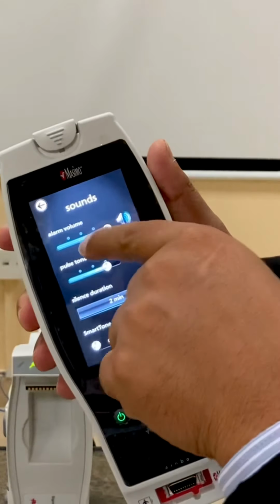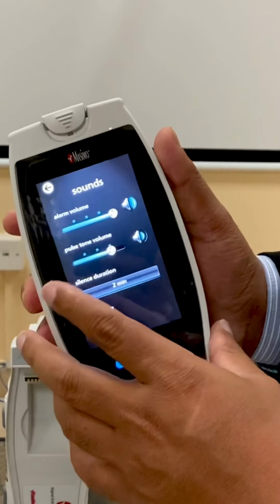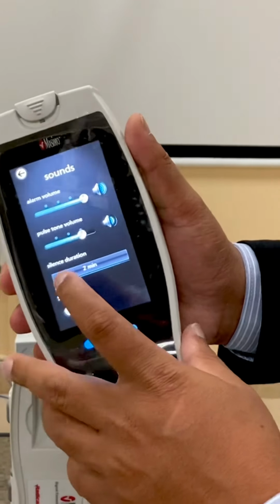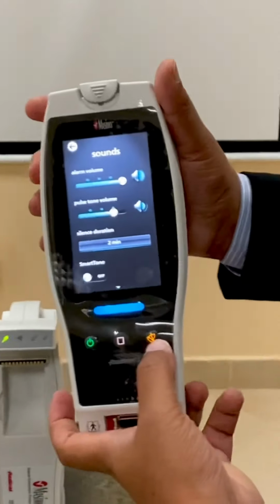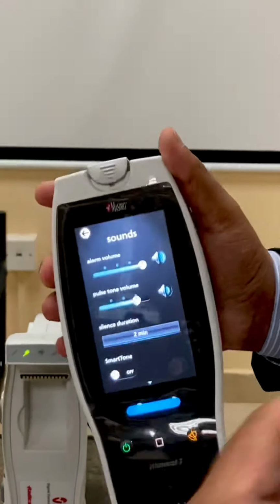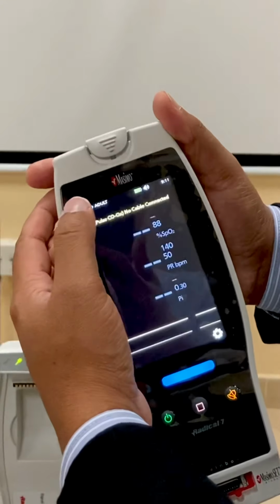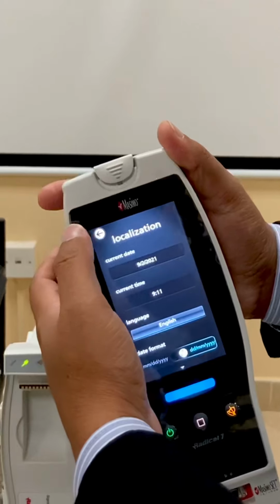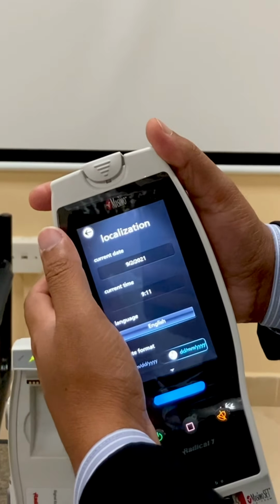You can silence the alarm volume. You can adjust the alarm volume, or you can adjust the pulse tone, and you can adjust the silence duration. Now it's set by default to 2 minutes. So once you press the alarm silence here, it will silence for 2 minutes. Then after that it will start again. That's the time and date. If you want to change anything, we never touched it. If you need to change it, we will change it for you.